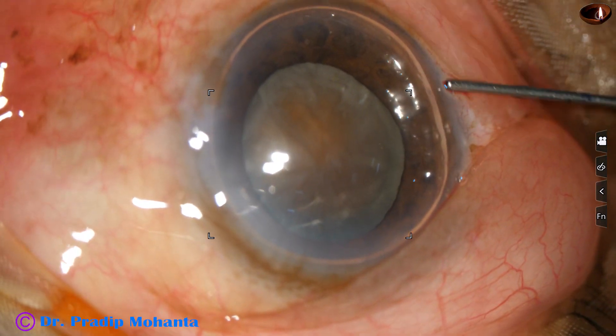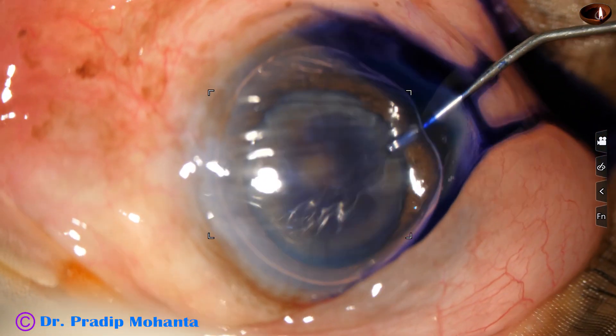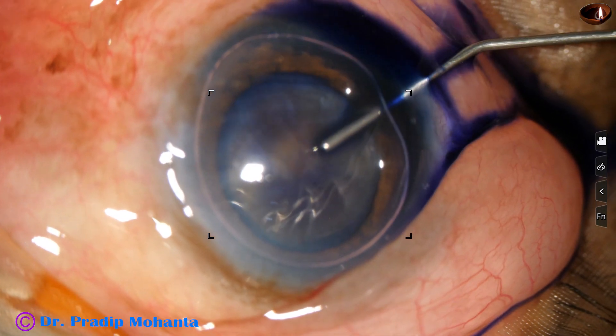By the way, this is a totally unedited recording, and you are going to watch each and every step of the surgery.